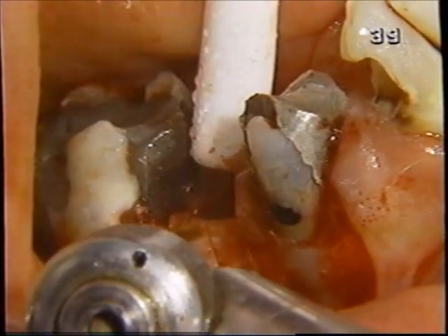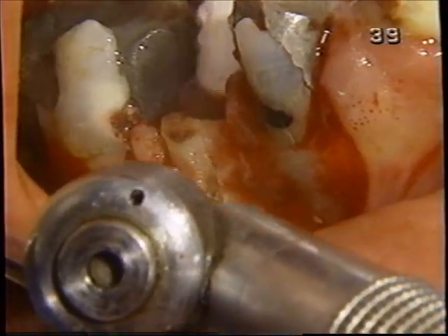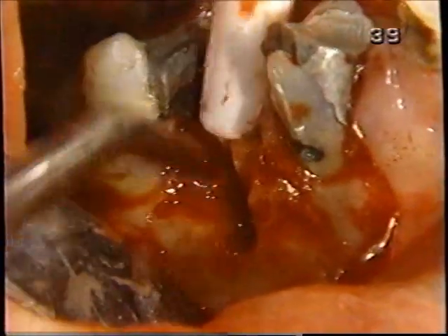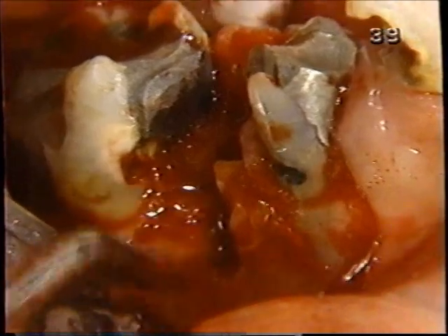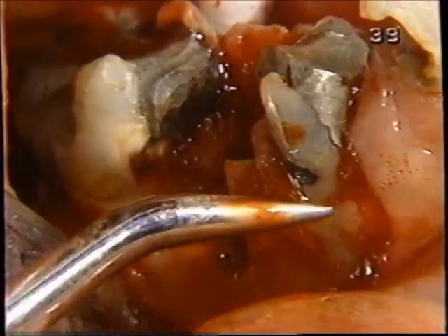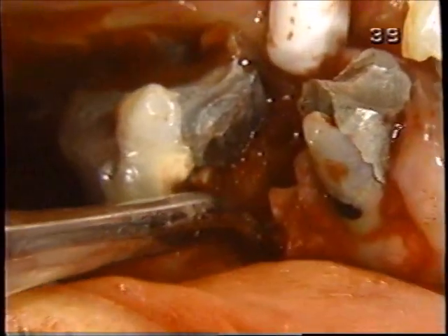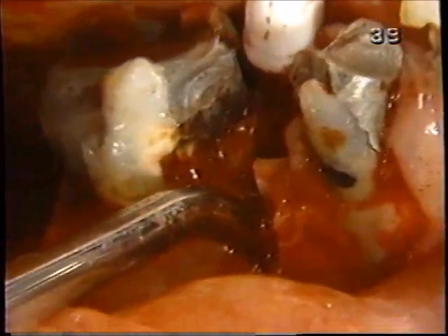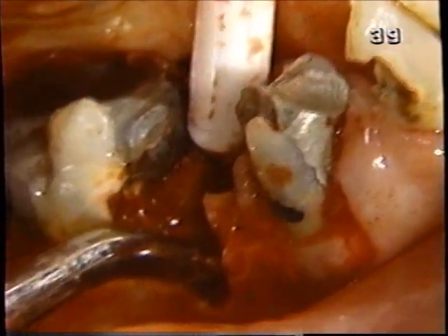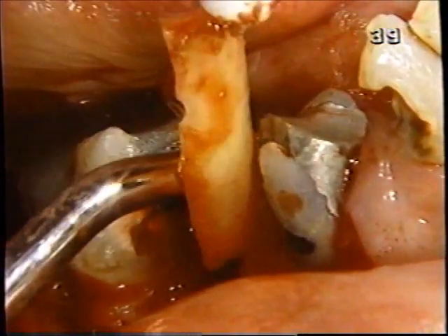Let's make a purchase point down here into the root. With the space that we have for us, we're going to use the Cogswell B, and if you take a look at the angle on that instrument, you can see it's very beneficial for what we're doing right here. A straight elevator wouldn't do well, a crier wouldn't do well. There it is. Let's take a look at that root.